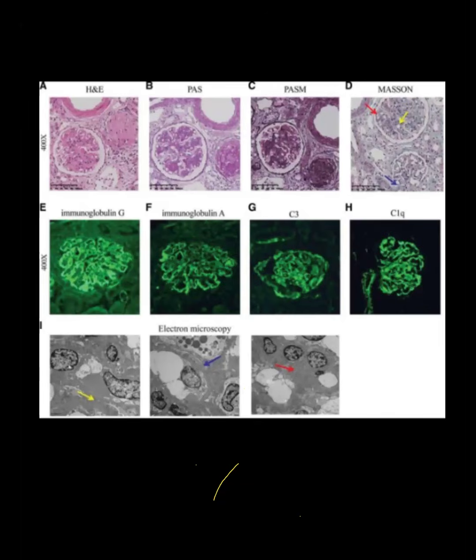Today, I will be discussing the different stains and their clinical importance, and the significance that is necessary for a nephrologist to know, so he can interpret the biopsy reports more easily and in a more convenient way.